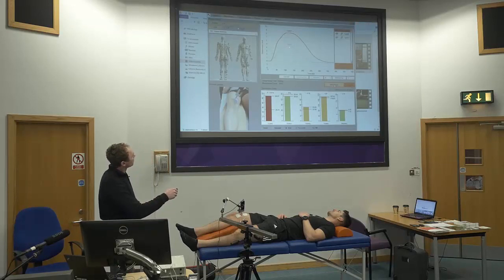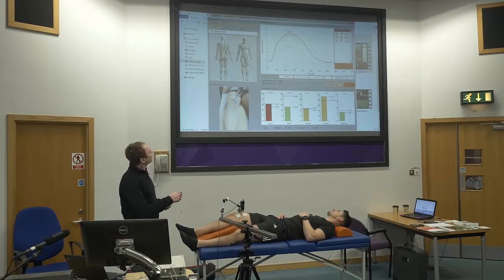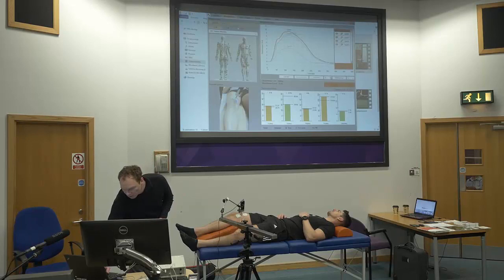This was the previous measurement, and this is the last one I did. I continue the same protocol until I get two responses which are exactly the same. The default number of previous measurements is one, but now we have six — just to demonstrate how the signal is increasing. I prefer to use just one previous measurement to see if there is any difference between the previous and the current one.